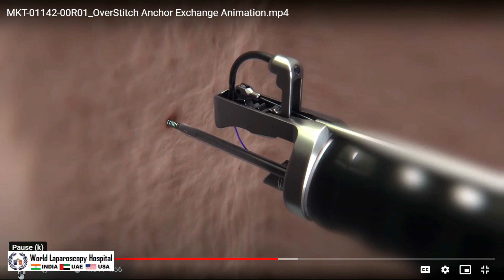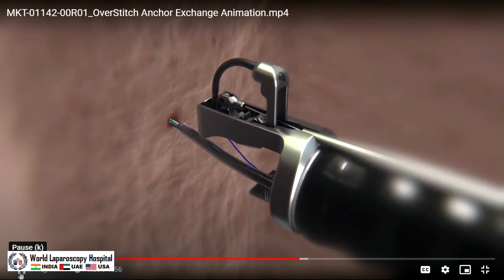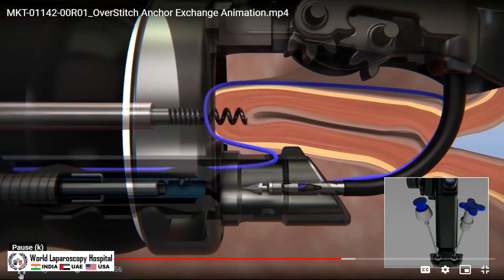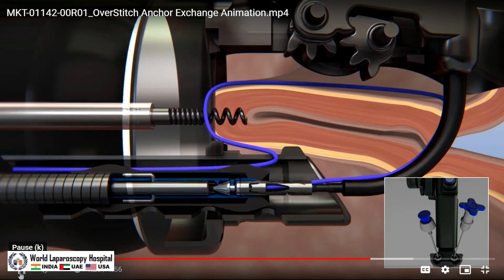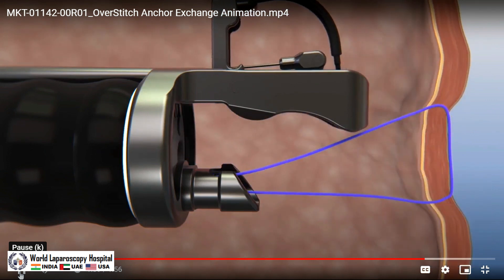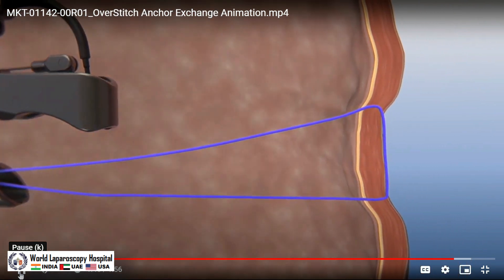To ensure a full thickness bite, maneuver the scope left so that the helix is right of the suturing tower. Pull the tissue until it reaches the scope. Close the OverStitch handle to advance the anchor and suture. Advance the anchor exchange over the anchor until the locking mechanism engages. Without pressing the blue button, pull the anchor exchange back to disengage. Turn the tissue helix counterclockwise to release from the tissue. Pull the blue cross button to retract the helix. Finally, open the OverStitch handle. Pull the scope back to create suture slack and prepare for the next suture. Repeat steps for additional full thickness suture placement.